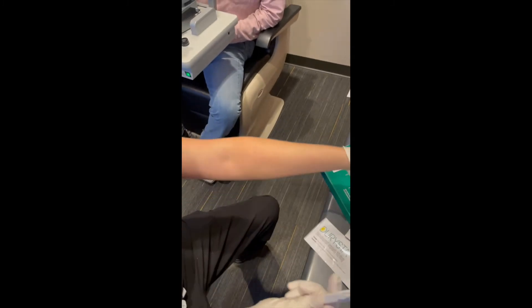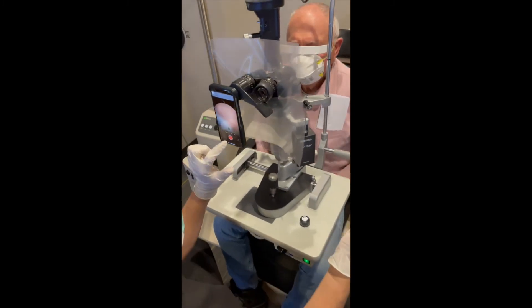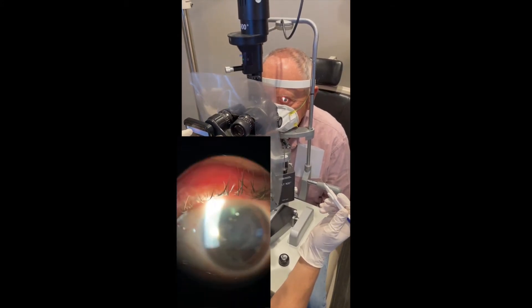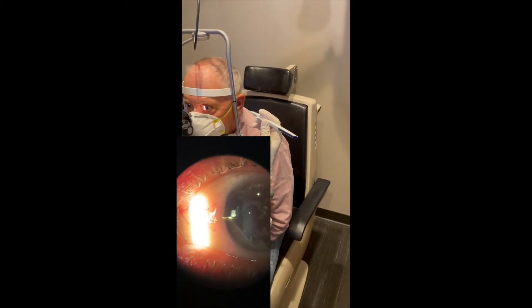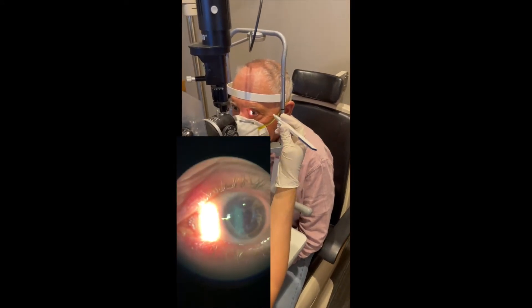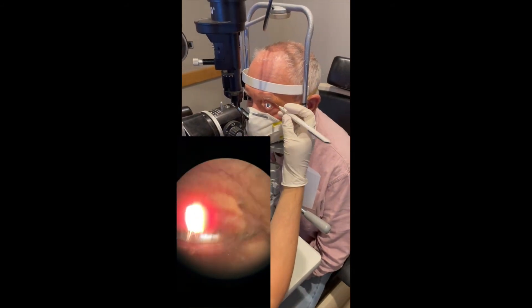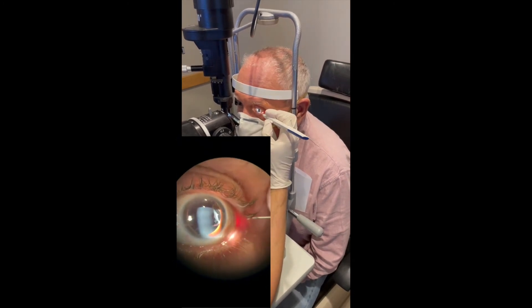Then I have the patient position themselves at the slit lamp. This can be done at a laser or under an operating microscope, but I prefer to do this at the slit lamp. I like to do this on slightly lower magnification of about 6.3. You can do this with or without a speculum. Either way, the patient is prepped with betadine first and some proparacaine.